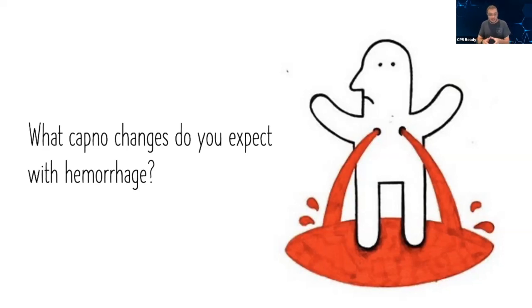So think about it. If they're losing blood volume, that means there's not enough blood to circulate to meet their body's needs. And what did we say? How is CO2 produced? It's produced through adequate perfusion. So the lower the perfusion, the less CO2 gets produced. And your capno, assuming that there isn't a disturbance to your ventilations, with normal tidal volume, normal breathing, will be low if someone is having severe hemorrhage and they have low perfusion.